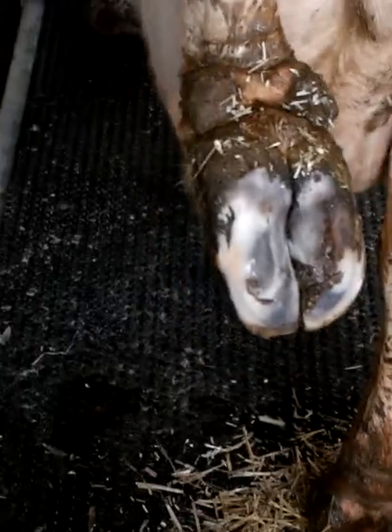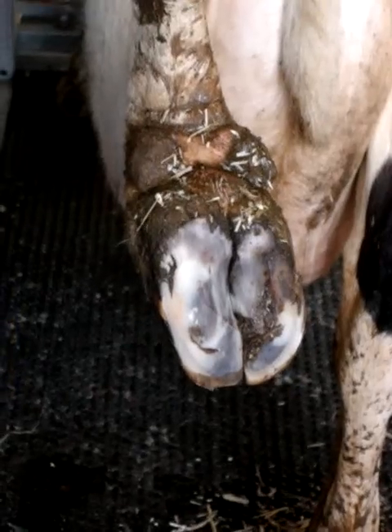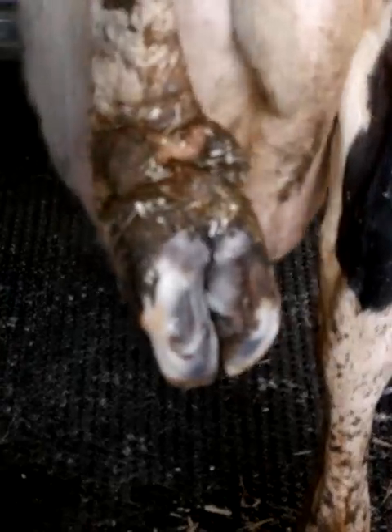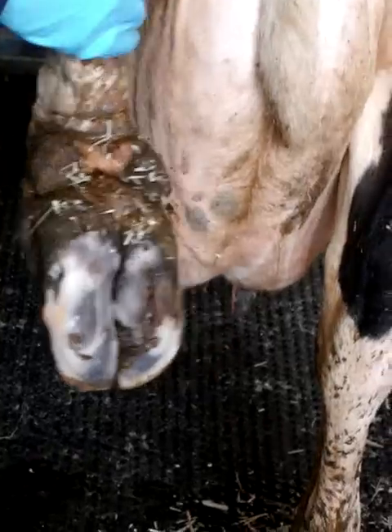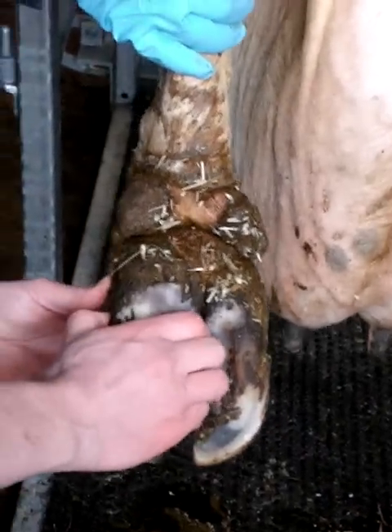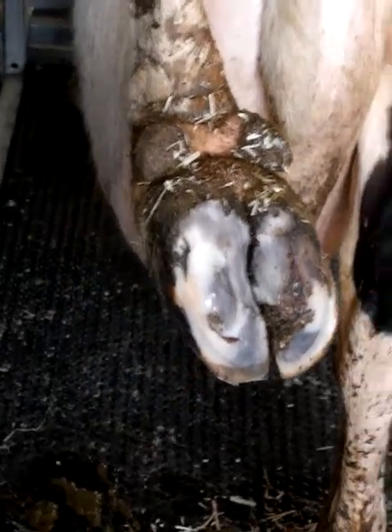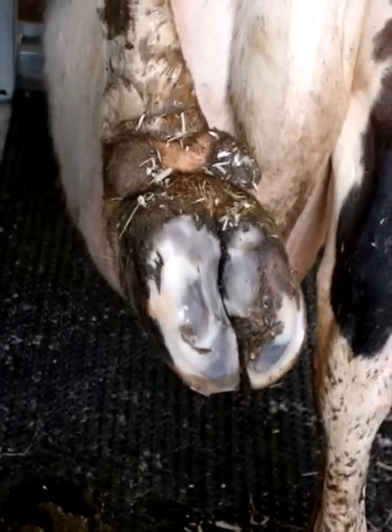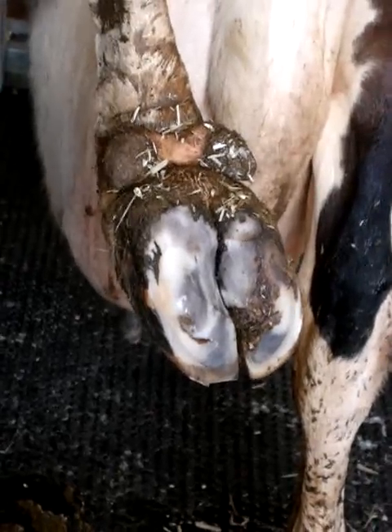So that's the end of what we call the functional trim, restoring the shape of the foot. You haven't had to do too much so far, and if you were working quickly, that would only take a minute to get to that stage. As I said last night, the problems usually then start to jump out at you. It's always worth confirming if you think there's a source of pain — just confirm you're on the right track. Rob, if you have a look at that, you'd probably think there might be a point that's painful around about there. You can use hoof testers, you can tap on the claw, you can twist the claw a little bit and see if she reacts. Even common sense sometimes — yeah, there's something pretty obvious there.